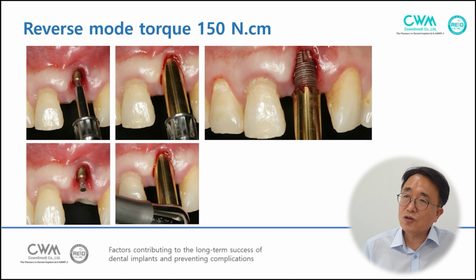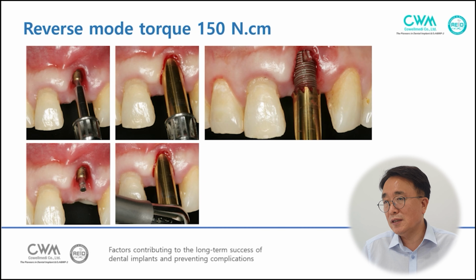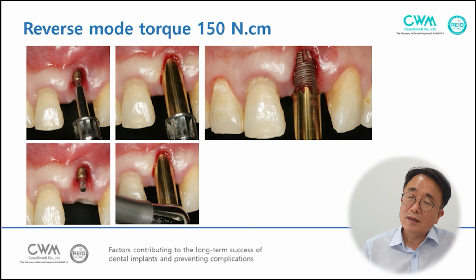So in the soft maxillary anterior case, it could be extracted with this instrument. But I recommend that if 150 Newton centimeter is not enough to remove, you have to use the trephine drill.